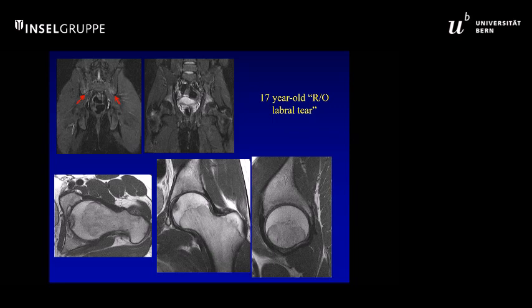So again, MR is a very useful tool. We use it for cartilage relaxometry, and Professor Kim is going to be showing some nice data to that end, but we use it extensively at HSS as a tool. It's important to think of all the pulse sequences provide, and it's fun to think about these new sequences that obviate the need for concomitant CT in these younger cohorts.